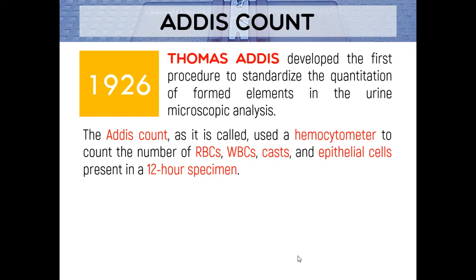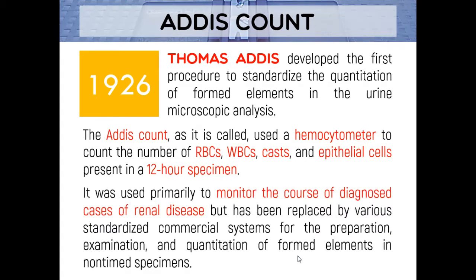In a way po, pwede nimo makitaan ng mga other cellular elements na wala nimo nakitaan if random lang ang ihi, okay? So this is quite important because again, especially if the patient is undergoing a pathological condition of renal origin. Because again, makita nato ang mga cells na present, okay, all throughout the day or all throughout this long period of collection. Okay, so in a way, makagauge ta sa severity of the kidney disease and in a way po maka-predict ta sa prognosis or maka-monitor ta, okay, sa progression of the kidney disease. And that is why, yes, the primary reason why Addis count was created.